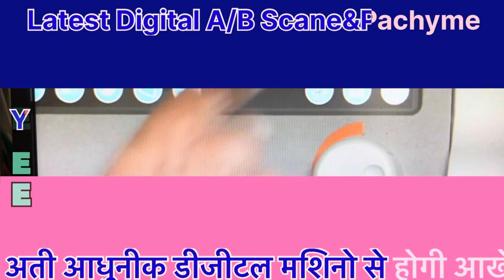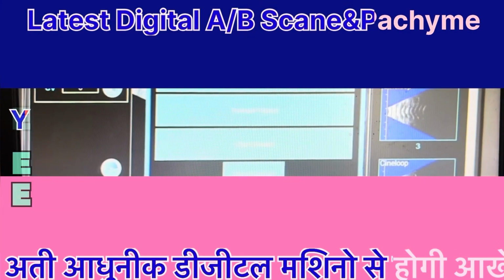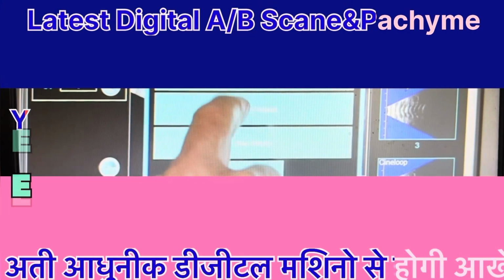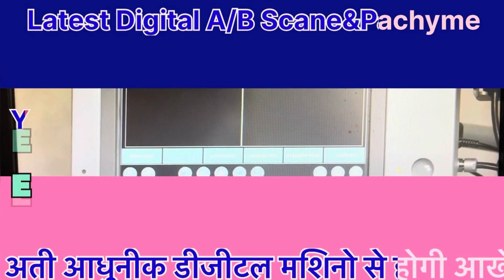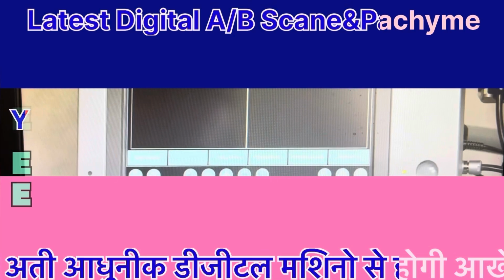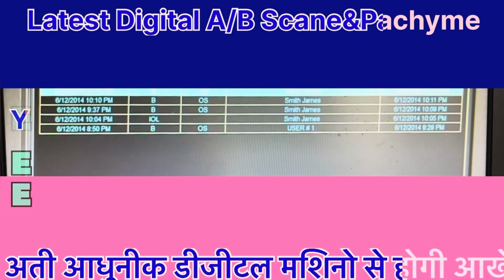With an image selected from the acquisition area or from the saved image thumbnails at right, choose Add to Report on the bottom toolbar. A small report icon will then appear at the bottom right-hand corner of the image thumbnail. To remove a selected image from the report, choose Remove from Report from the toolbar.